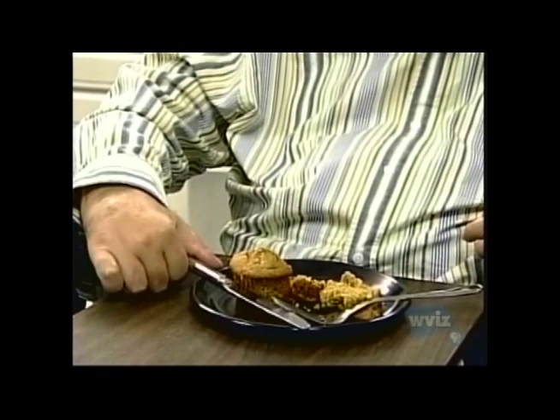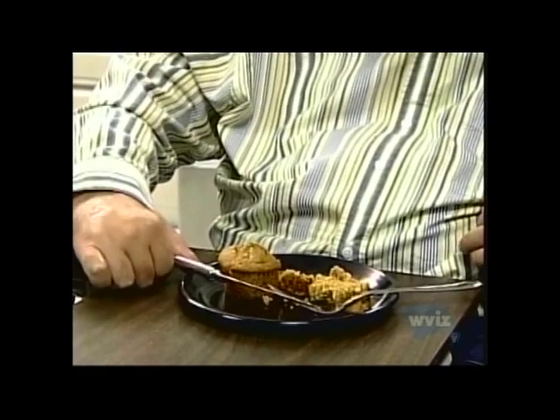So after you implanted these devices, Lou is now able to manipulate much more with fine motor control, is he not? Yes, he has many more muscles to use in his hand for opening and closing the fingers, but also to transfer objects between hands, and to also use normal implements like a normal pen or a normal fork, whereas before he had to use specially adapted equipment. This additional independence is, I think, very valuable because it's more normal.